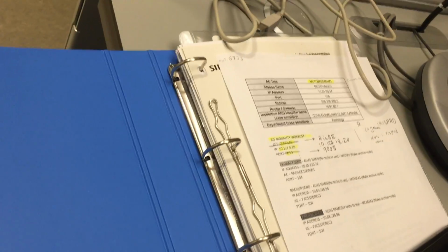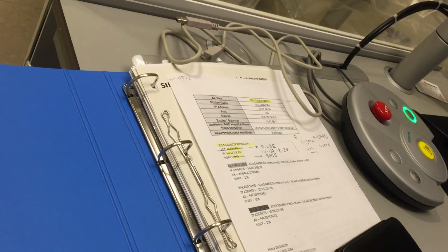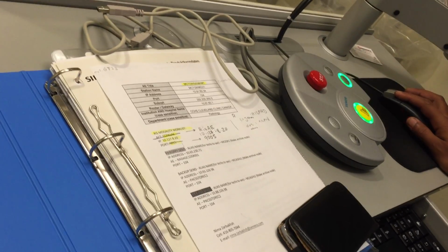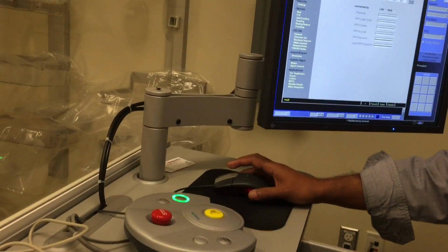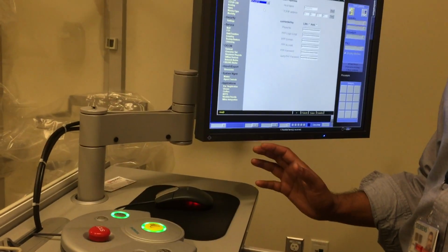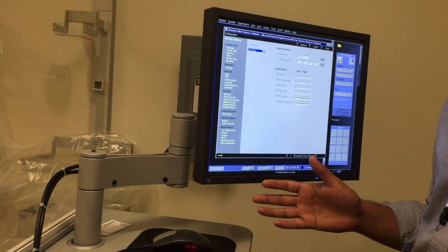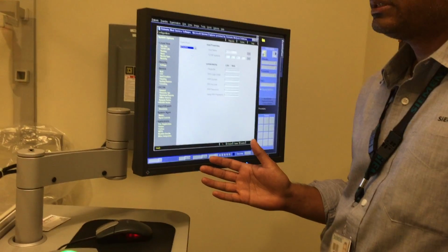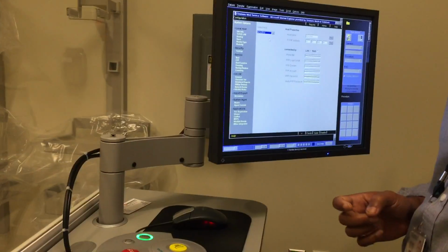So you can see here on the screen, this is our PACS info, and that is our RIS, which, it seems to be, for me, the names showing AGFA. Okay, they have existing AGFA. So there's the histories, work list. The work list where the patient comes, gets registered at the front desk, and then here on the patient browser screen, we see the patient list. The technologist doesn't have to enter the patient demographic info manually. She just picks the patient, the info is there, she just enters the exam type and then starts the patient procedure. So very quick.